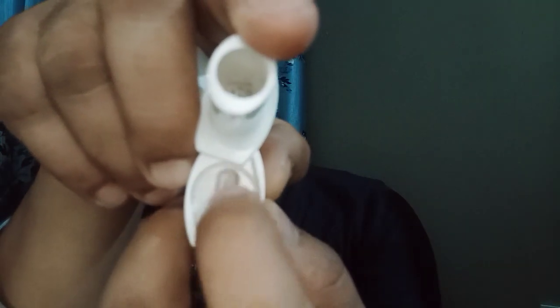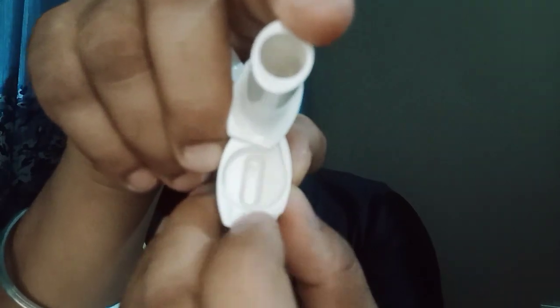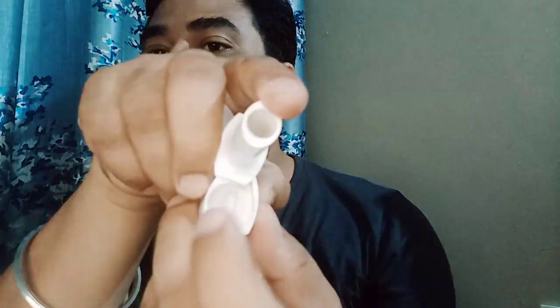After you open this, you can see a gap, a space in between. In this space, the capsule has to be fit. Now I am taking out the capsule and fitting it.